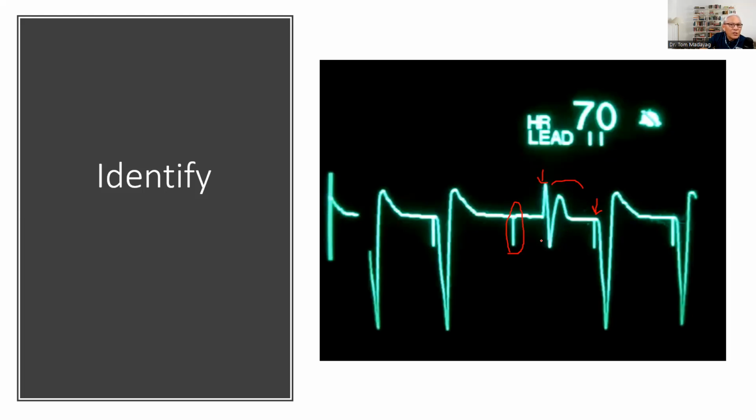Okay? So with that in mind, are there any questions as far as that is concerned? Loss of sensing and loss of capture. Clear? Okay. How about the others? Great. Let's move on.